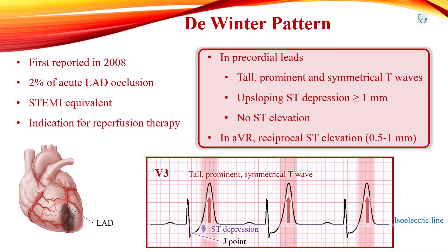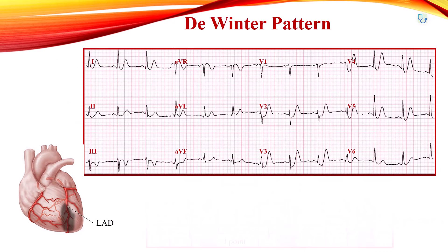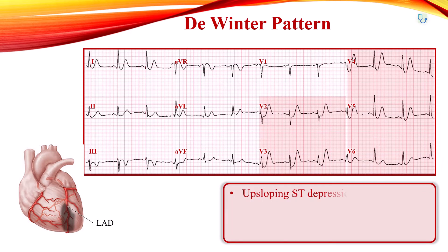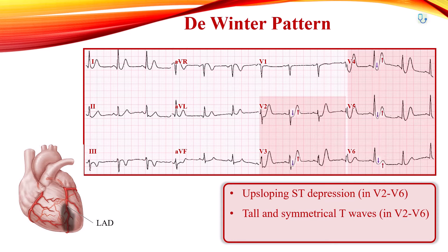In this EKG, the DeWinter pattern can be observed. Leads V2 to V6 show upsloping ST segment depression with tall and symmetrical T waves. There is a reciprocal slight ST elevation in AVR.